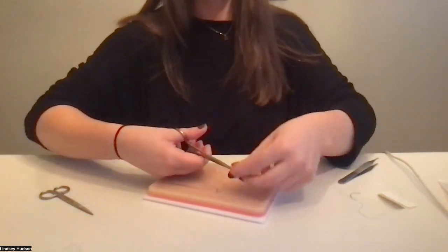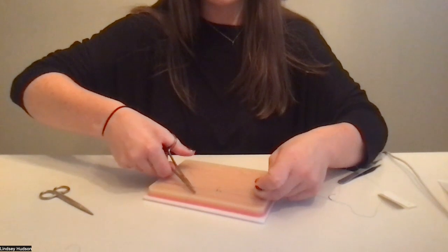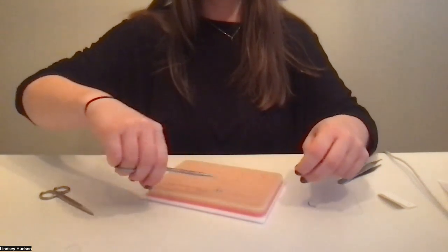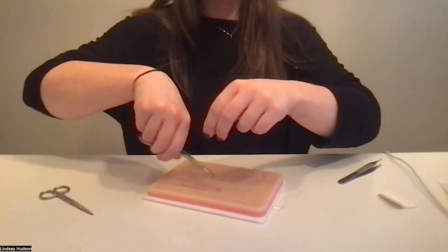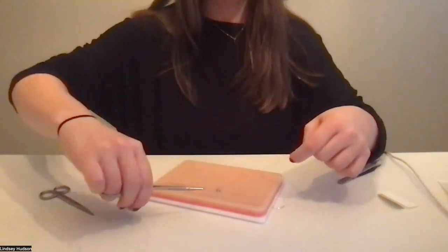And now you're going to go under 1 time. Grab your tail and pull it through. Go over 1 time. Grab your tail, pull it through. Go under 1 time. Grab your tail that keeps running away and pull it through.